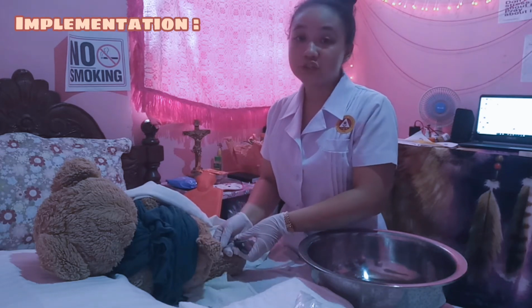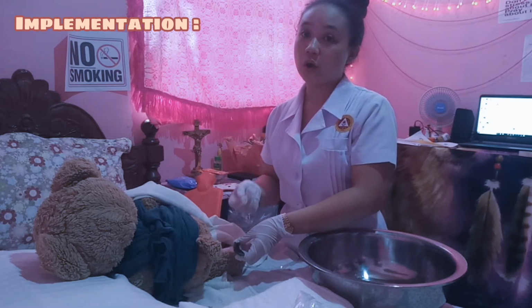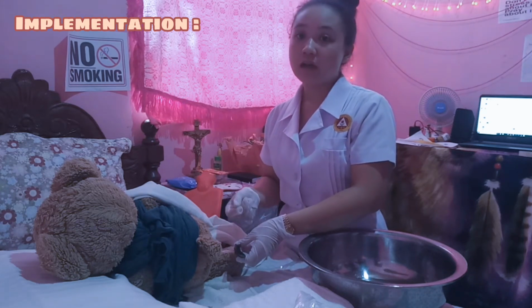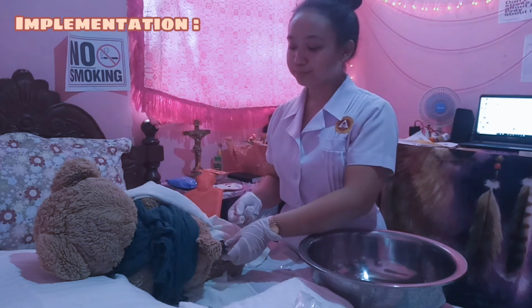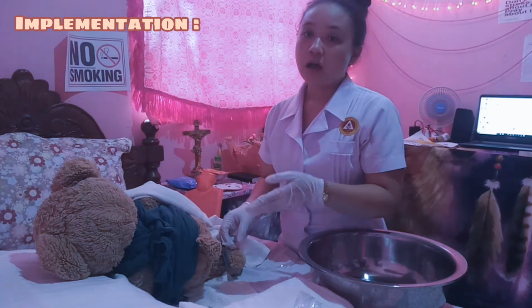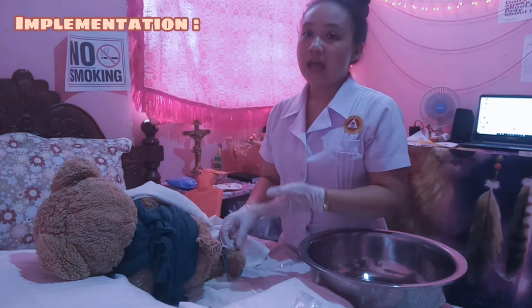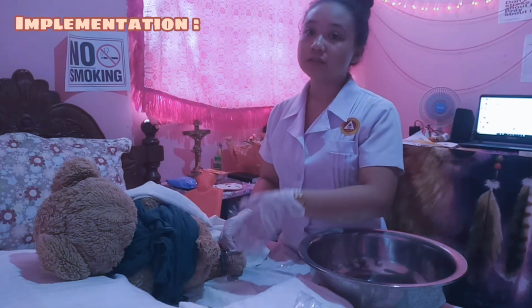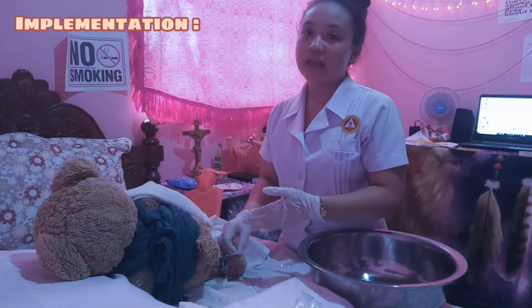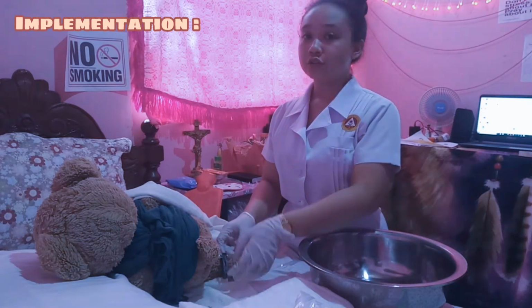You need to insert the tube 7 to 10 centimeters or 3 to 4 inches. If resistance is encountered at the internal sphincter, ask the client to take a deep breath and then run a small amount of solution through the tube.